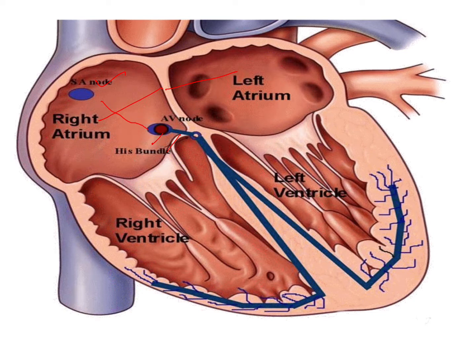The delay at the AV node usually occurs when the heart is in diastole, so that the maximum amount of blood can be filled in the ventricles, and when the ventricles get depolarized or contract, the maximum amount of blood can be sent to the systemic circulation.